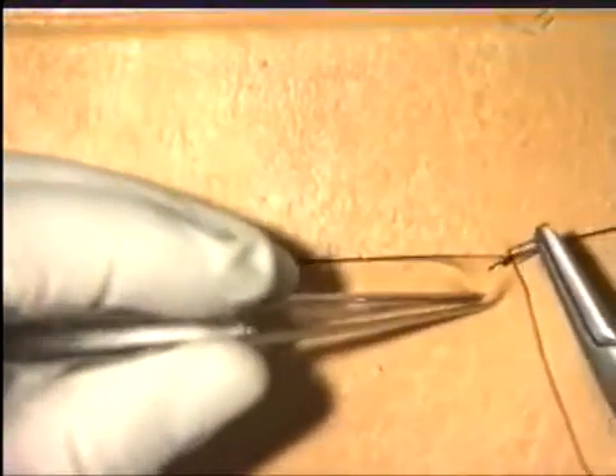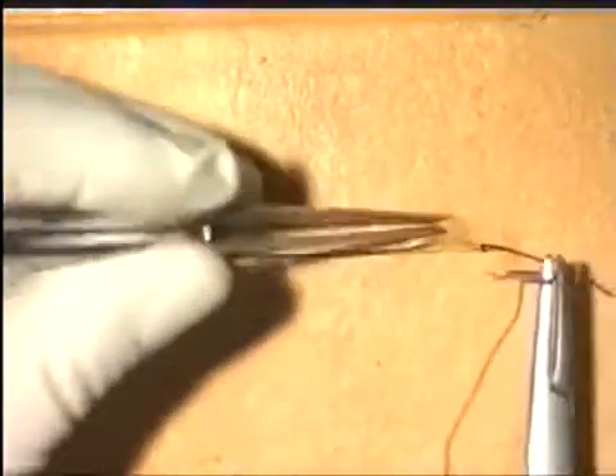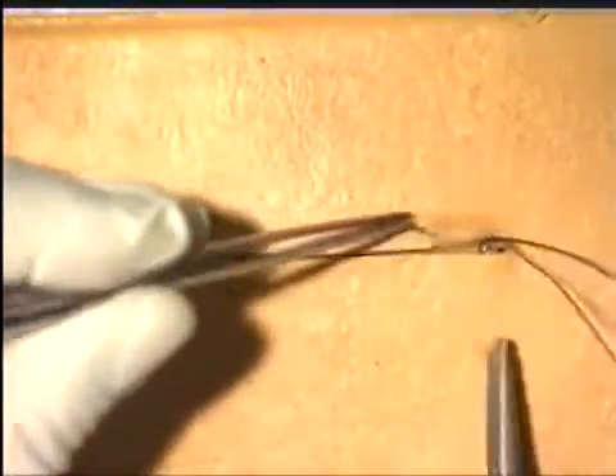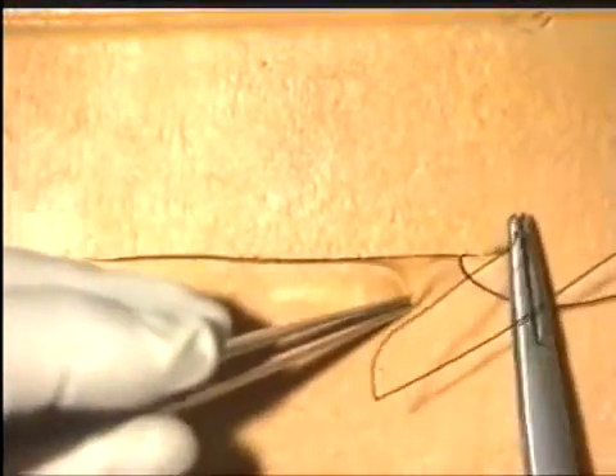Then, using the forceps, carefully retract the skin edge. Take a small bite of the subcuticular material and pull the suture through. Then on the opposite side of the wound, insert a similar subcuticular bite of the suture material and gently work up the wound, ensuring that each bite does not go too deep into the tissues.